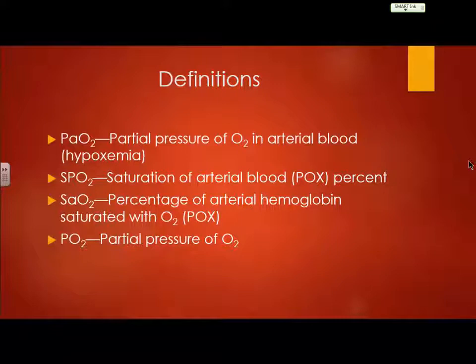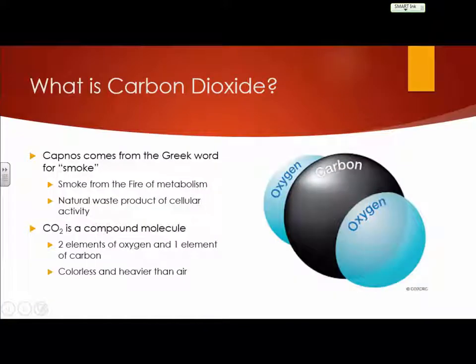What bearing does that have on us in the field? Not a lot, other than understanding what we're looking at and what we're working with, because we're not going to draw blood gases and adjust ventilatory settings and things like that based off of blood gases. Our main monitoring when it comes to this is going to be that end-tidal system. All right? So, just quickly understanding carbon dioxide and the terms here. Capnos comes from the Greek word for smoke. Smoke from the fire of metabolism.